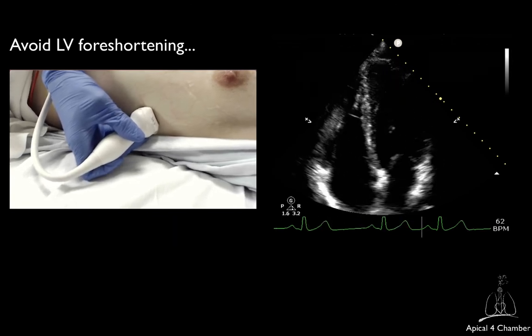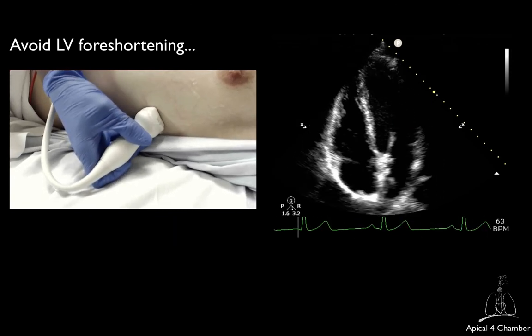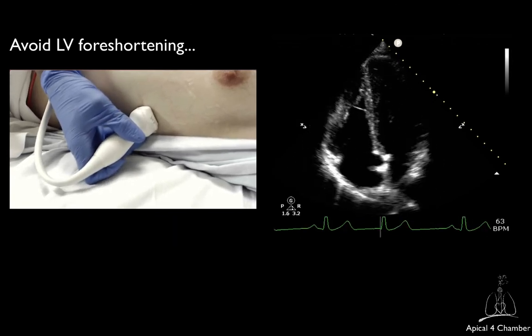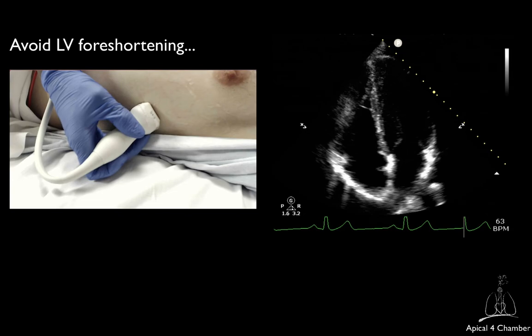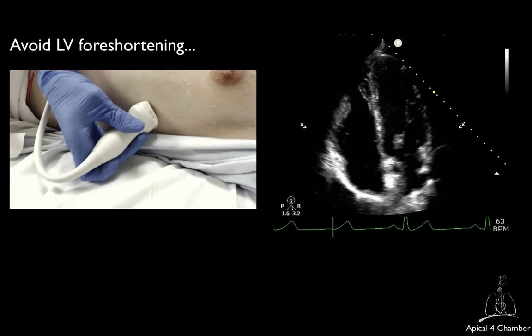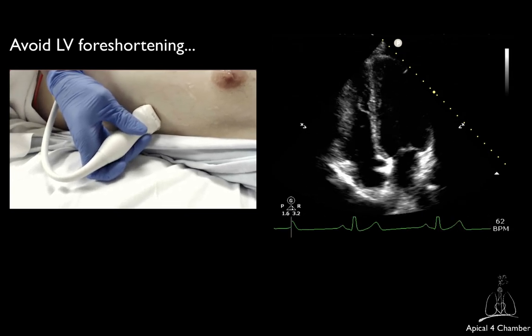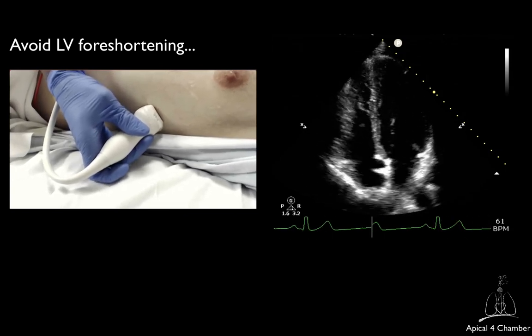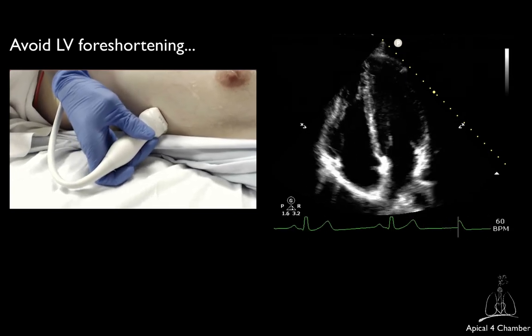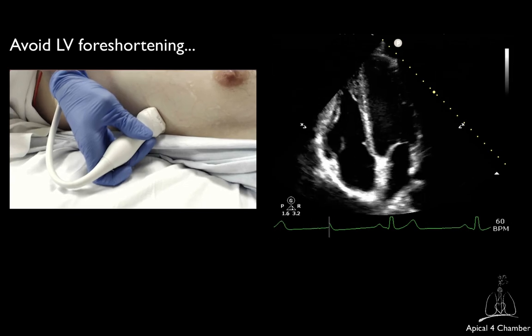Of note, in very thin patients, you may have to position the transducer partially over a rib to obtain an adequate view. Make sure not to apply too much pressure as it can be quite uncomfortable.